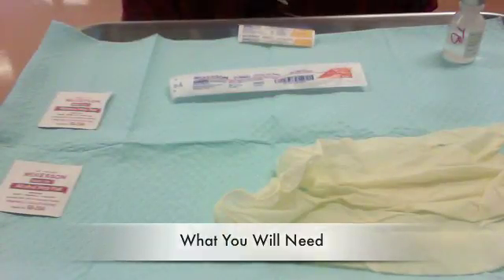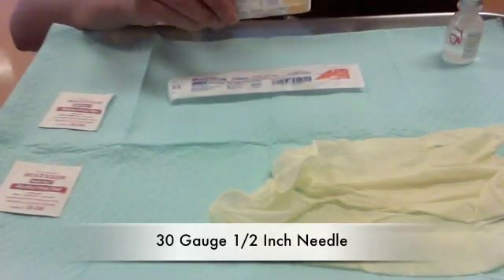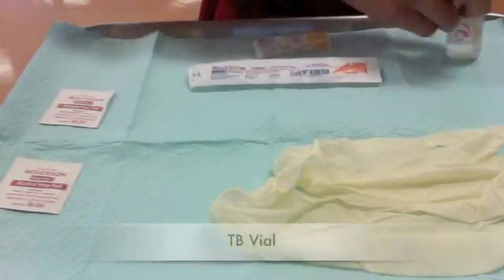What you'll need for a TB test is two alcohol wipes, a 30-gauge 1/2 inch needle, a 1cc syringe, gloves, and a TB vial.